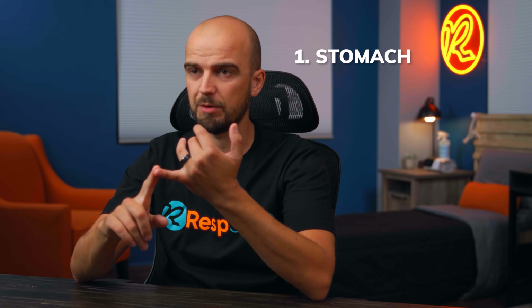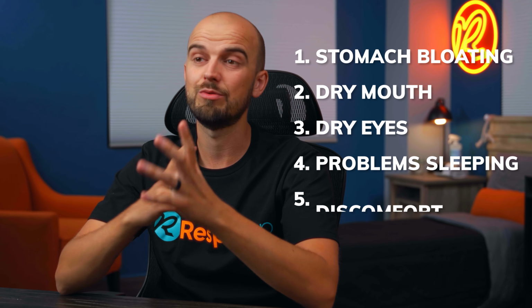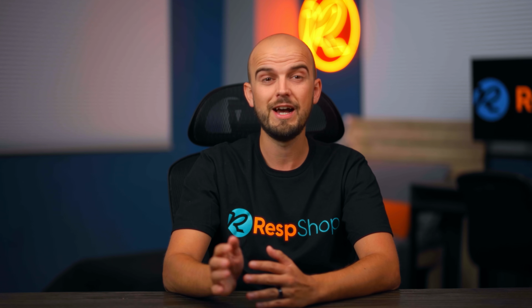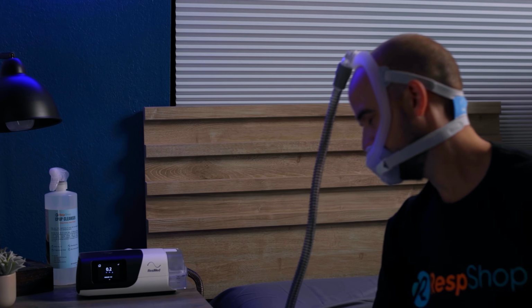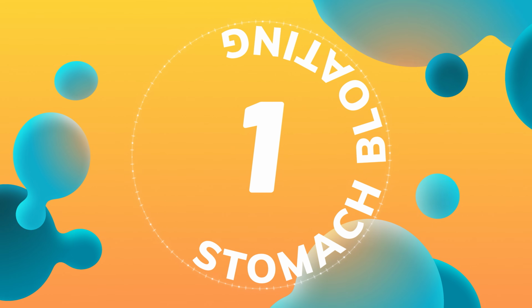I'm going to cover stomach bloating, dry mouth, dry eyes, problems falling asleep, and general discomfort. Now, most of these issues can be fixed with some setting and equipment tweaks or by adopting some simple best practices, so don't let them get in between you and that glorious realm of sweet dreams. It can be hard at the beginning, but trust us, it's worth it. So let's start with problem number 1, stomach bloating.